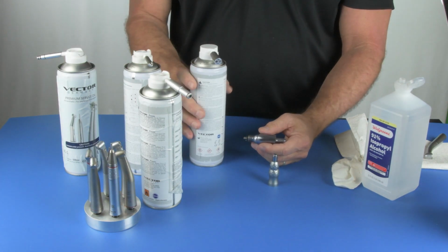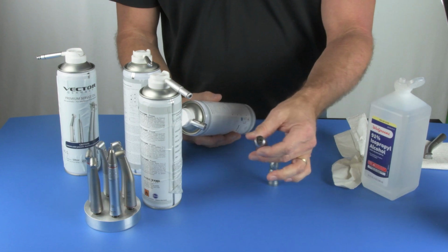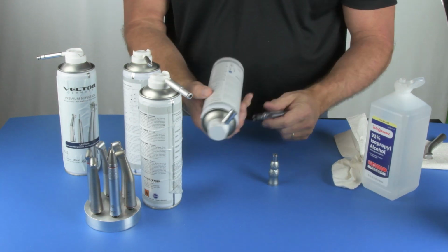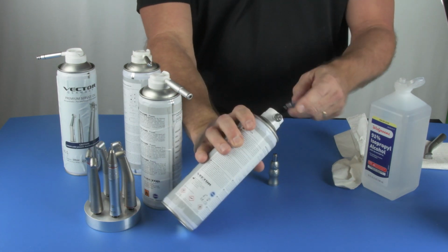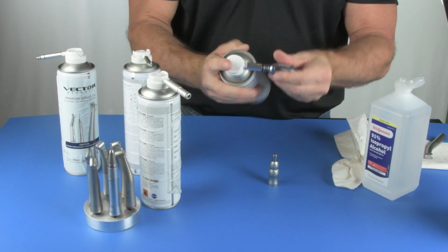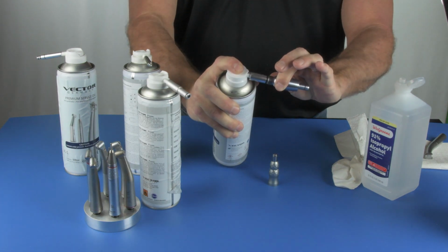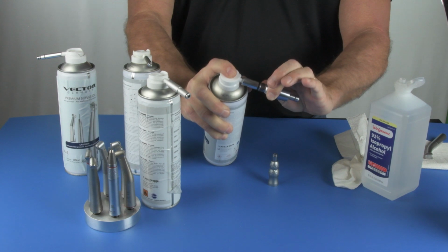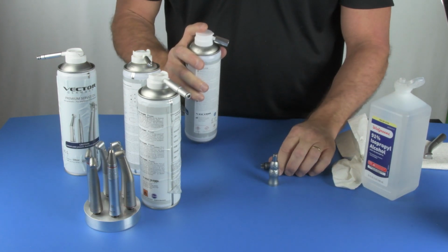So most hygiene handpieces, again, have a 4-hole back end is what we call it. There's tubes sticking out that screw down. So you're going to want to get the type of adapter that has the multiple holes in it to line it up so you can only lubricate it one way. Spray it for 2 seconds. Now this is an air motor and it is going to have to be expelled. So run it for 2 seconds. Go ahead and put it down for a moment.